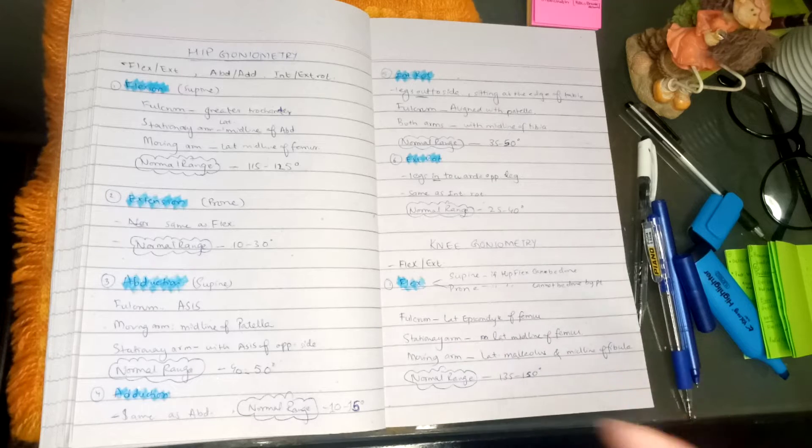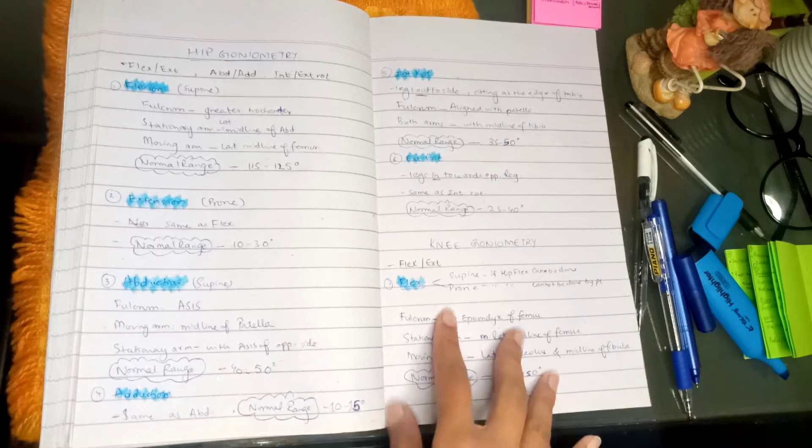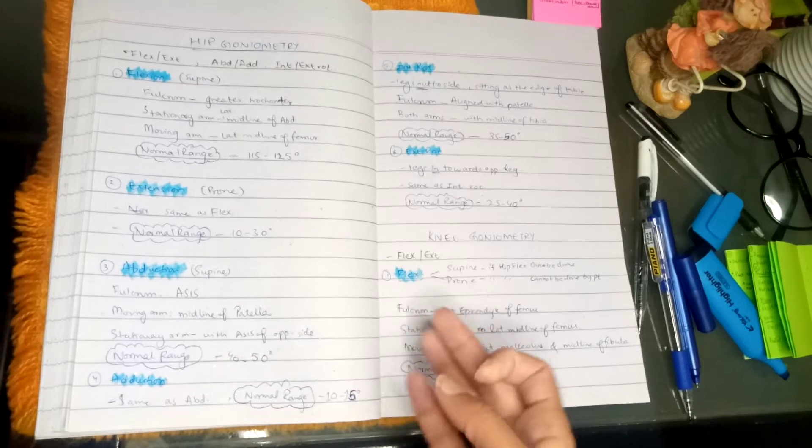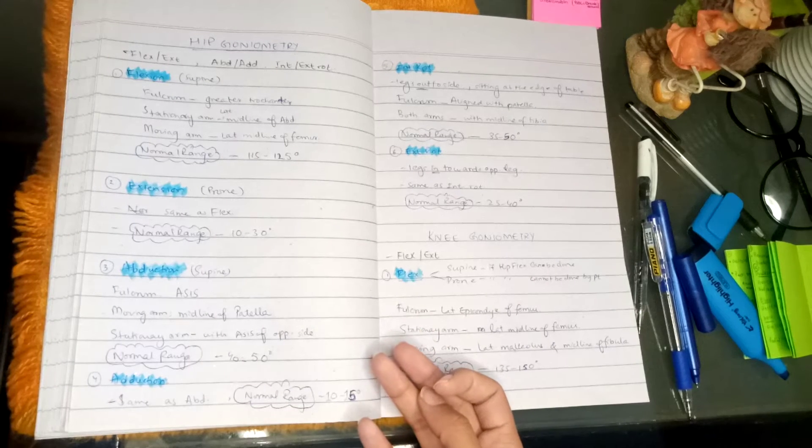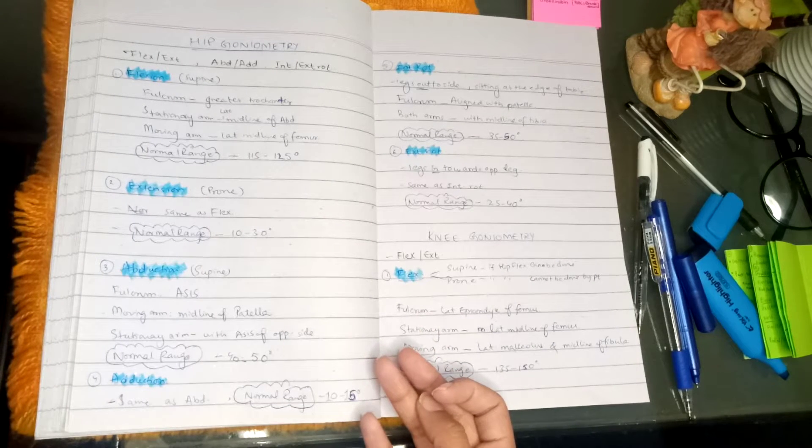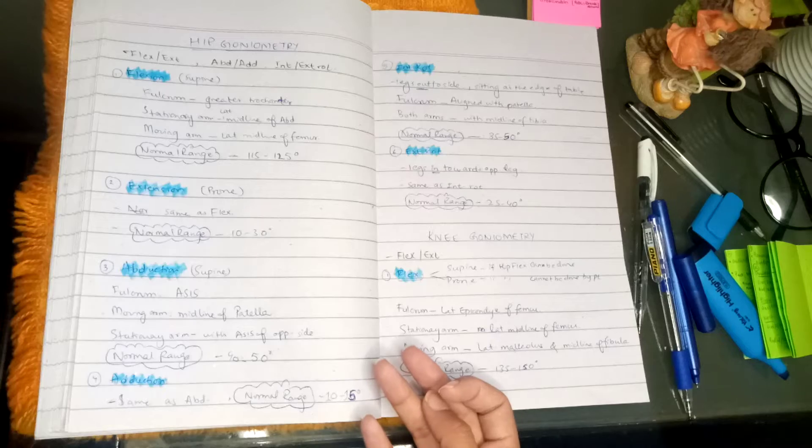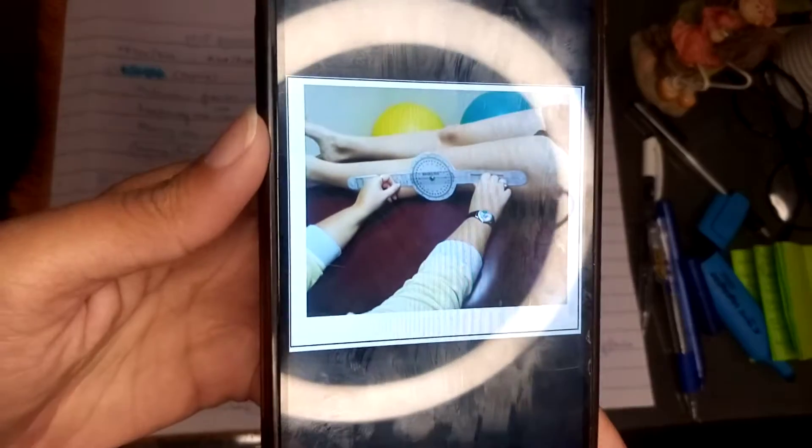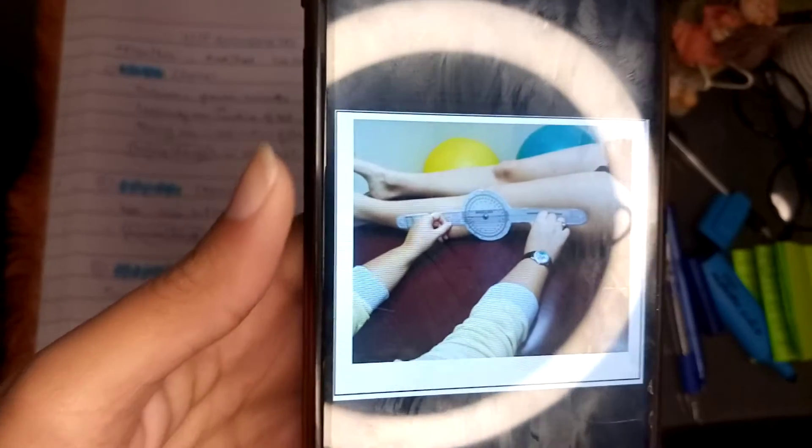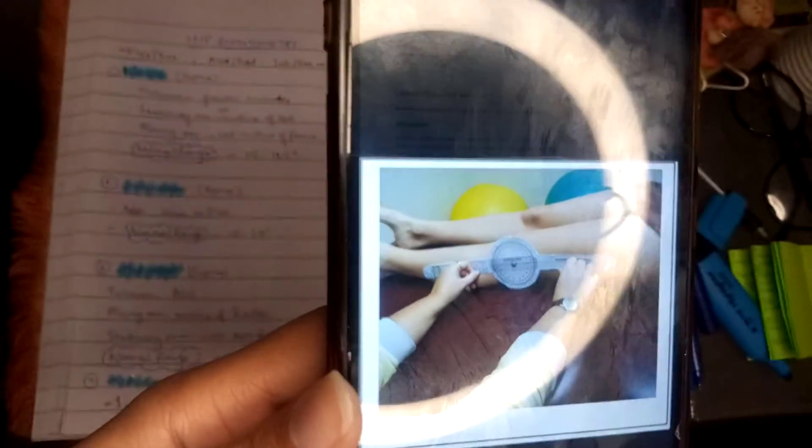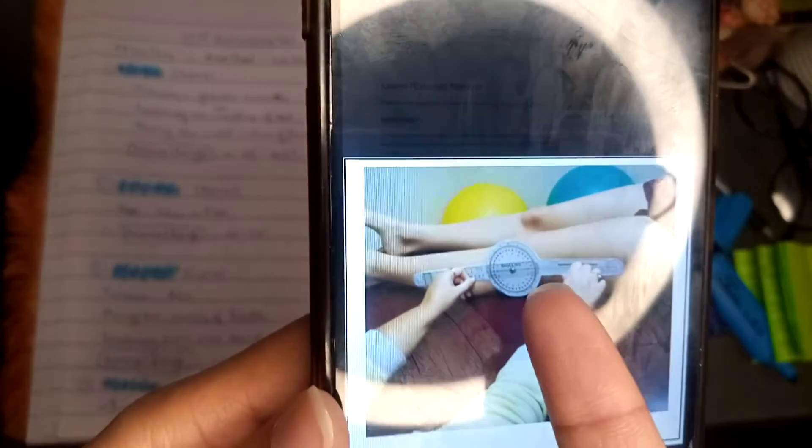And then we flex the knee. Now we have to place the fulcrum. Let me show you the picture. So here you can see we place the fulcrum at the lateral epicondyle of the femur.